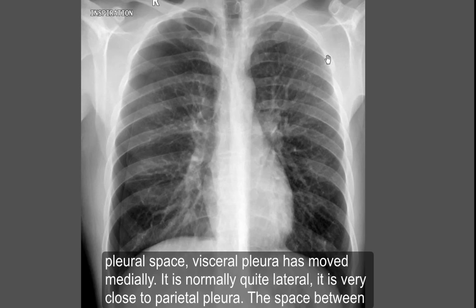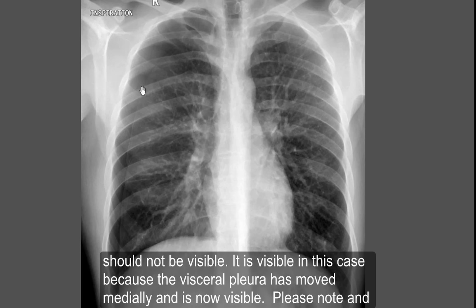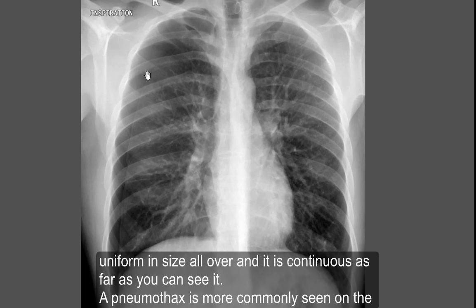The visceral pleura is very close to the parietal pleura, and the space between them should not be visible, as you can see on the left lung. It is visible in this case because the visceral pleura has moved medially. Please note that the visceral pleura is paper thin, uniform in size all over, and it is continuous as far as you can see it.